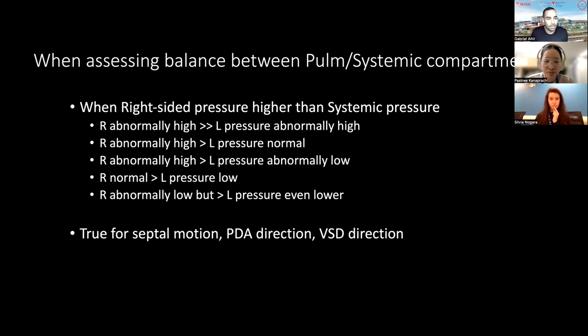What's happening in my left atrium? What's happening in my RV? What's happening in my LV? What's happening outside of the heart? What's happening in my lungs? Where is my blood flow going? Where's my oxygen? My preductal sat, my postductal sat, my blood pressure in each compartment.